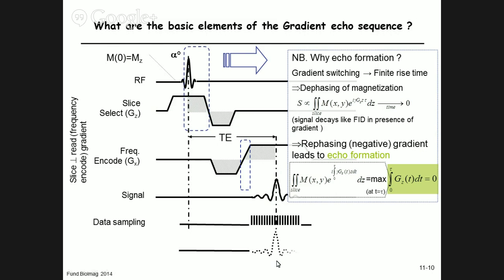And that's actually what the computer sees. The computer sees, after it's gone through the analog digital converter, just a bunch of numbers that are stored in memory sequentially in an array. The first half of the echo is also measured. That's because it produces more signal. There are additional data points that can be measured.